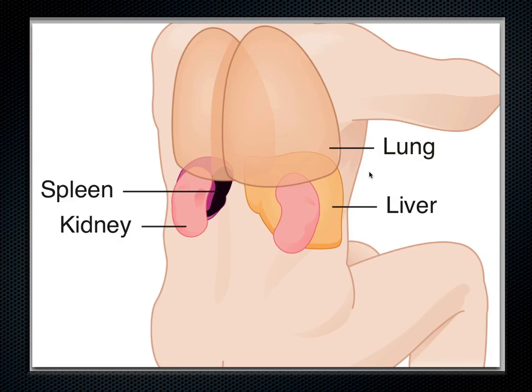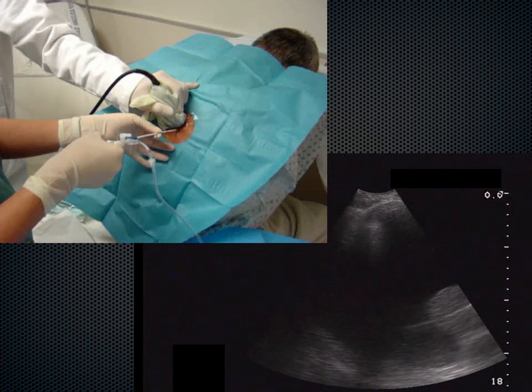And here's a great example of why we use ultrasound, because if you are tapping out the lung to figure out where the dullness is, to figure out where the fluid is, well, let's say the fluid is layering here. Well, the dullness you're hearing may be lung, that is fluid. It might be spleen, it might be liver, it might be kidney. You don't really know. If you're sticking your needle in this region and you're not sure exactly where the diaphragm or where the fluid is, then you may be inadvertently performing a liver or spleen biopsy. Okay. See my needle.